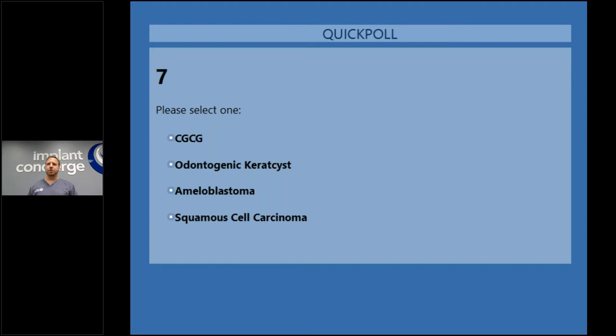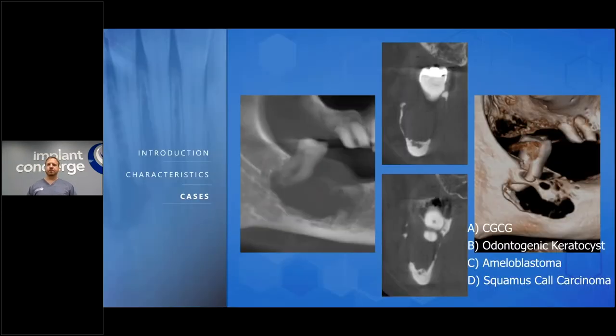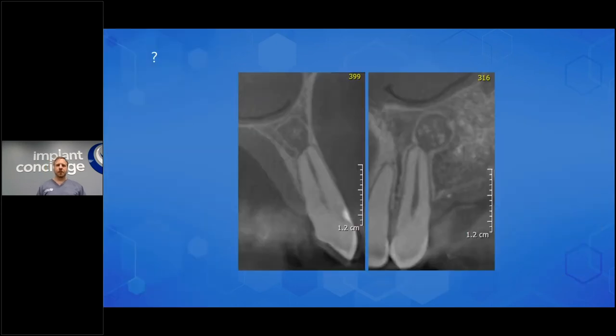And we got about 70% of people saying squamous cell carcinoma. All right, this one, I don't even know what it is. The patient can't get a biopsy. I followed up with this patient over a 2-year period at the university. I was lucky enough that they still had paper charts of hers. If you want to make a guess, the giveaway was that's bone graft.